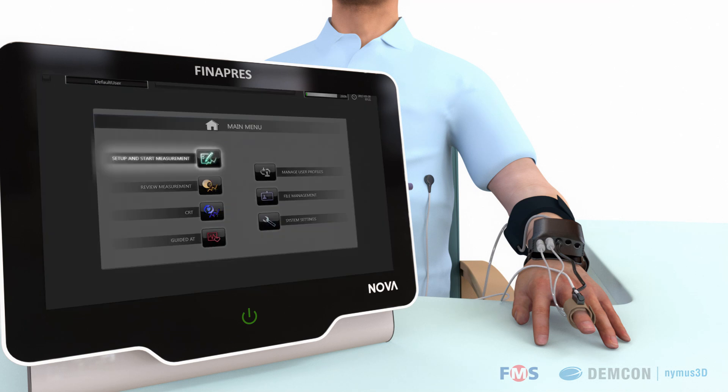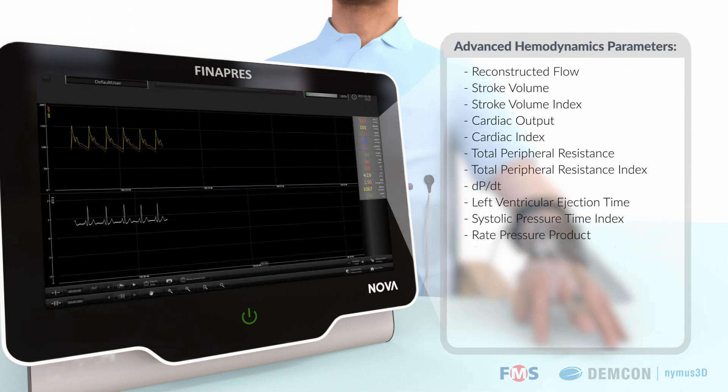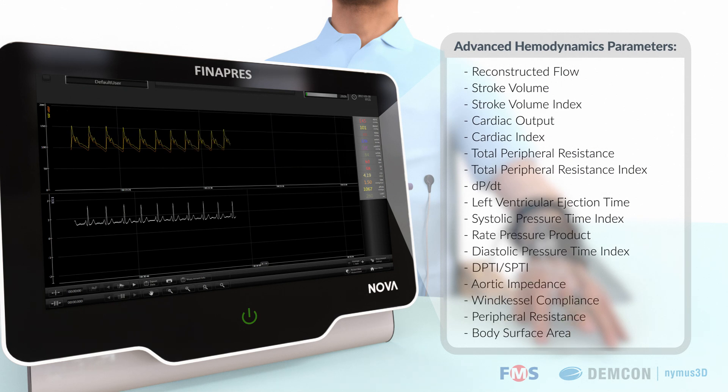The Advanced Hemodynamics application shows more parameters derived from the blood pressure to enable physicians to do a thorough hemodynamic evaluation in a very short time.